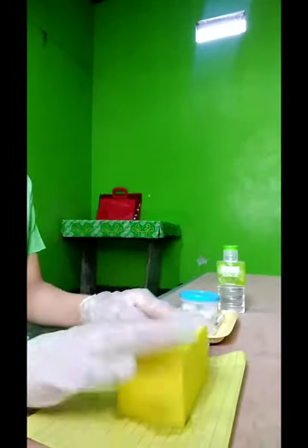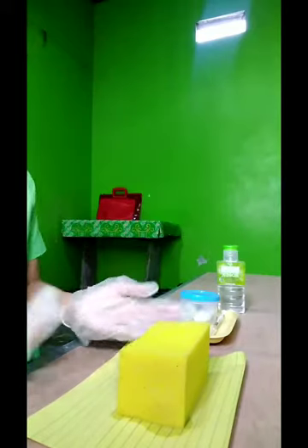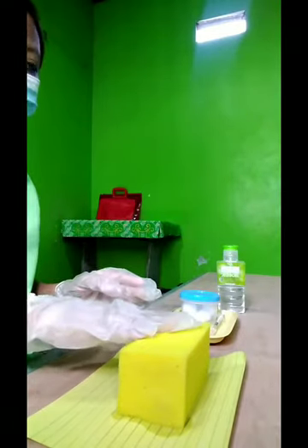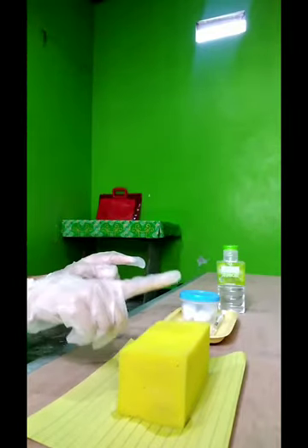Select an appropriate administration site. Assist the patient to an appropriate position for the site chosen. Drape as needed to expose only the area of the site to be used. Identify the appropriate landmarks for the site chosen. Clean the site with an antimicrobial swab.